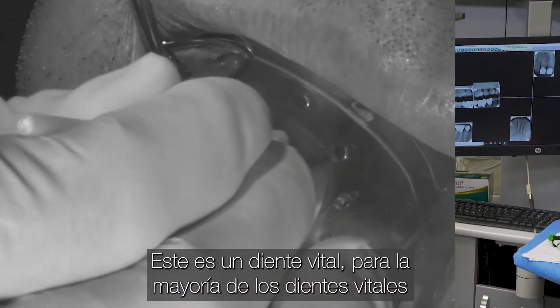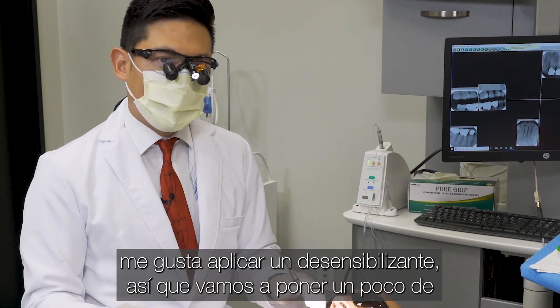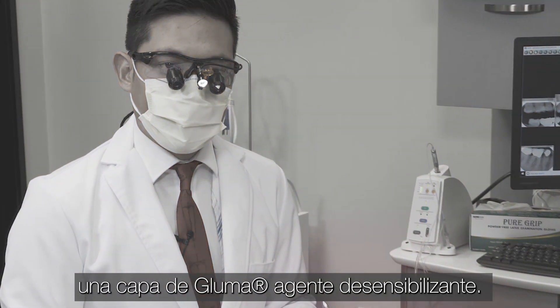This is a vital tooth. For most vital teeth, I do like to apply a desensitizer. So we're going to put a little bit of a layer of gluma desensitizing agent.